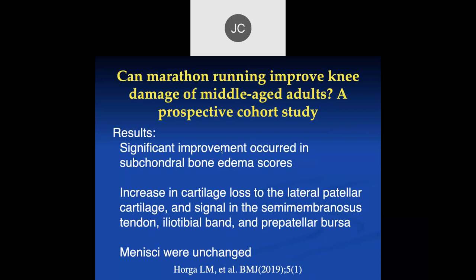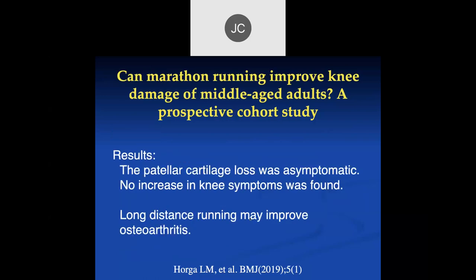Okay. So those patients who had subchondral bone edema that we see typically with articular cartilage disease, after running the marathon, instead of having more edema, almost all of them had no edema. So it markedly improved the edema scores. There are now some more recent papers that have shown that as well. And their symptoms were much improved over this time. The menisci were unchanged. A lot of them had degenerative meniscal tears, but surprisingly, those meniscal tears were not worsened by training and doing a marathon. They had a little bit of increased cartilage loss in the lateral patellar facet, and some signal in the semimembranosus tendon, but none of these were symptomatic.